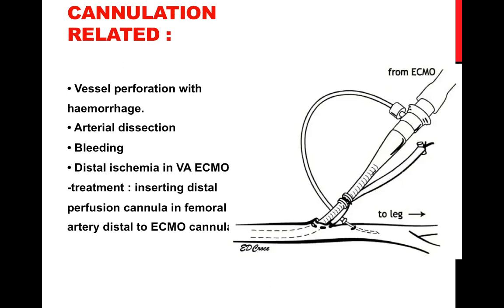If the patient is staying for a prolonged period and you really took care of the bleeding, you might close the sternum and wait for a couple of weeks or so until you anticipate recovery for the ventricles. If you would think that this is going to be a 2-day or 4-day ECMO, 5 days ECMO, like sometimes even post-heart transplantation with a marginal donor, you don't close the chest. You just keep it open. You even observe the bulge if there is a bleeding. You treat it accordingly. But as I'm saying, it's a case-to-case thing.